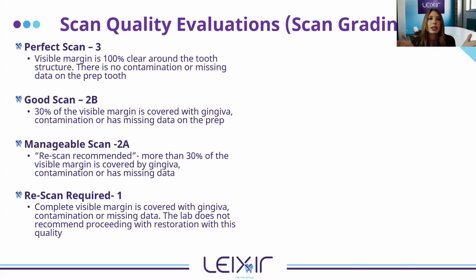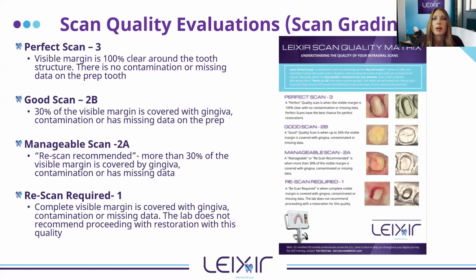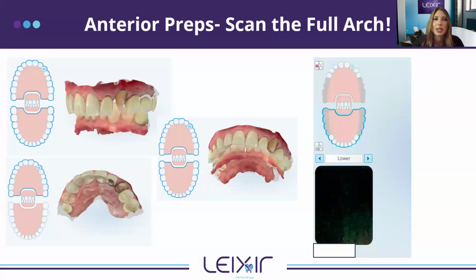So here again at Lexier, this is our grading metrics on how we're evaluating your scan. So we have perfect, good, manageable, and rescan required. And there's our little sheet there showing that. So I'm going to just go through some cases so you can see here.